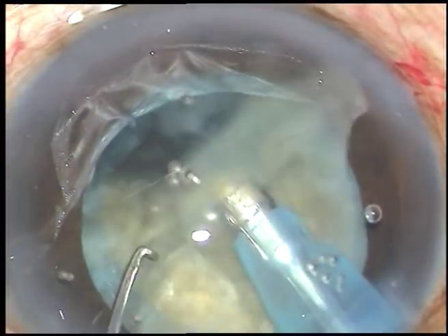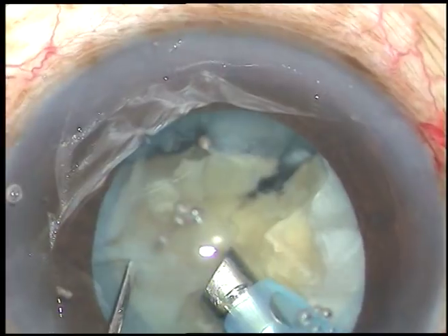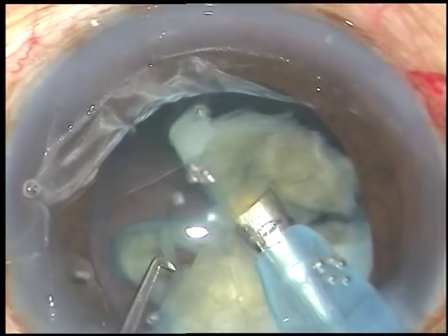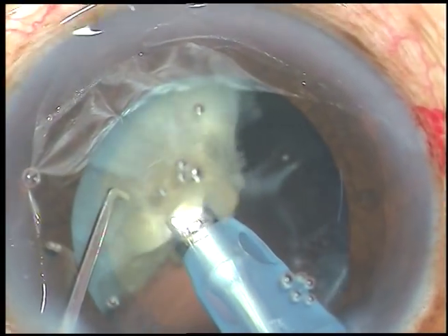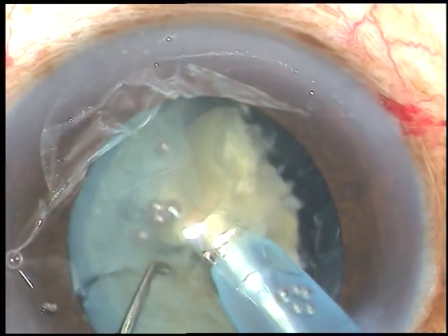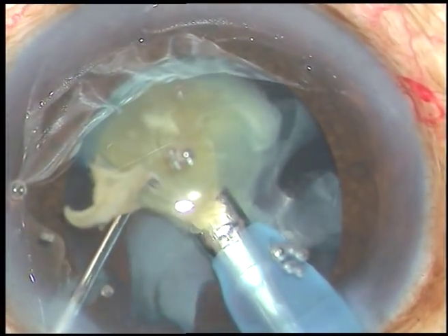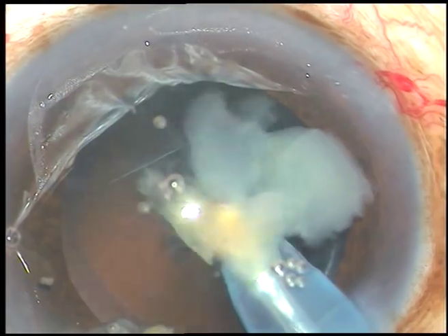Now, each fragment is emulsified and removed. Dear colleagues, this is a very economical machine — you can use any machine, even the Appasamy Galaxy Pro, AMOS Compact, or Laureate. Whatever machine you use, if you raise your competence to another level, you can do very safe, very fast surgery. Once you become competent, you automatically do fast surgery and don't waste time in the anterior chamber. Endothelial cell loss becomes minimal and it becomes a very good surgery.